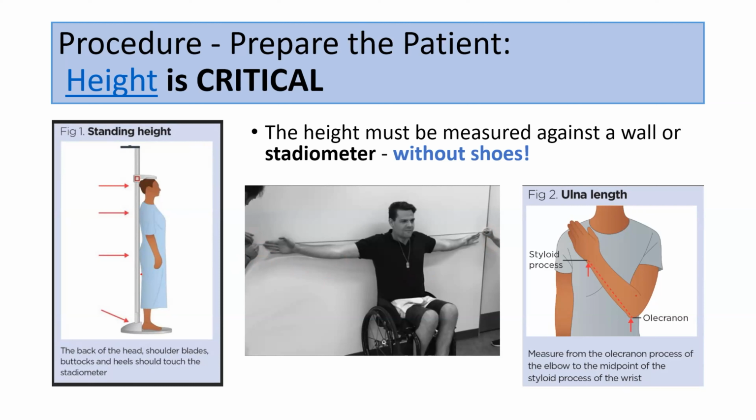True story. A patient came to me for a pulmonary function test. The indication for the test was a previous test, which was highly unusual and made me very suspicious. But I decided not to prejudge by looking at the previous tests. I went in, I completed his pulmonary function test, and then I pulled up the old test. And I'm looking through, and all of the absolute values are essentially identical. And I'm like, why did they come and get another test? Then it dawned on me. The percent predicted was very different, significantly different.